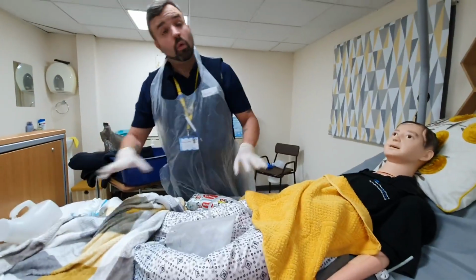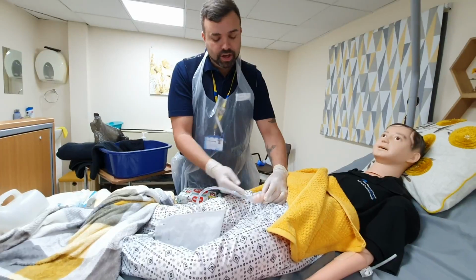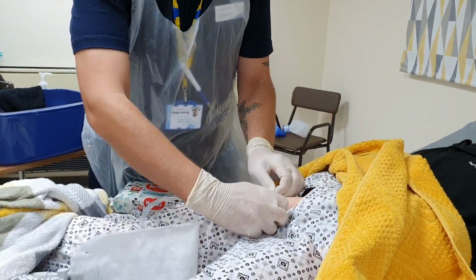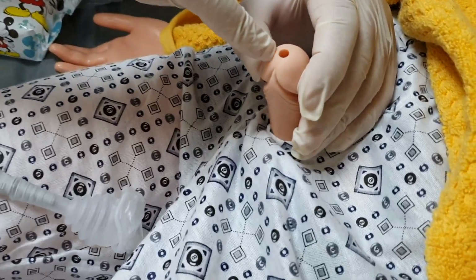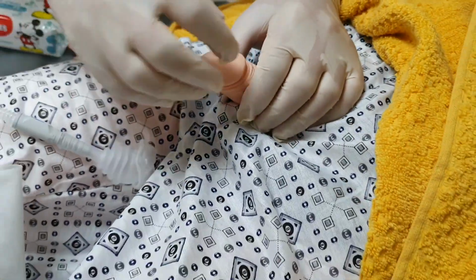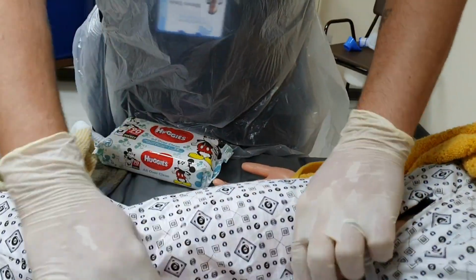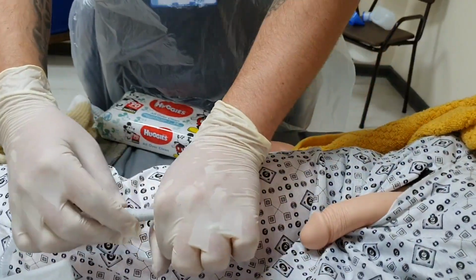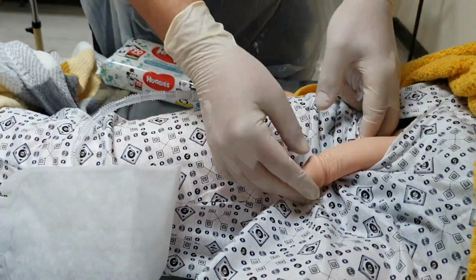Now, catheters work in a very similar way. So the only difference is with a catheter, rather than it going over the penis, it goes through the urethra. So if we take this off, a catheter would go straight through the urethra and into the bladder, and there's a little ball that blows up and it sits in there. So again, what you will see is a plastic tube coming out of the penis like this with a little hook, and the two just connect, so it's the same thing. And that's no different to the female catheter, so that's fine.